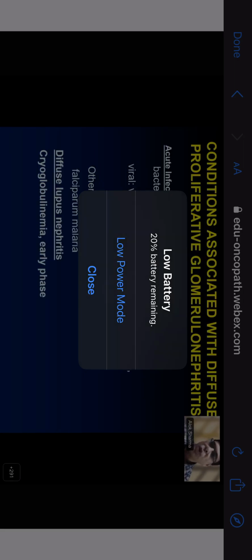And as I just told you, there can be several etiologies. That's why we keep on using these terms, patterns, because there are multiple etiologies to the same pattern. So apart from the infections, you can have the same pattern in lupus nephritis. Patients with SLE can also have the same pattern. And even cryoglobulins and other things can induce a similar pattern of injury. So based on your IF and EM findings, we'll be able to differentiate what their etiology is, right?